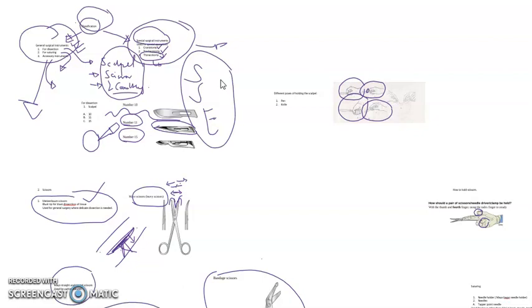Whereas instruments that are used for suturing or connecting tissue are what we're going to discuss in the next short video.